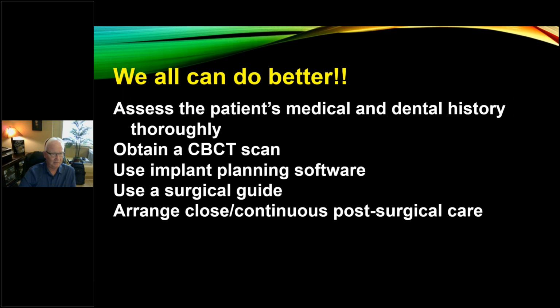Follow up with the hygienist, instruction at the time before you let them go, close monitoring radiographically, post-operatively, maybe at a 3-month, 6-month, annual interval initially, and determine, are they the patient that's only losing that 0.5 millimeter a year of bone, or have they got some other problems going on where they're not in control, or they didn't do their oral hygiene the way they should have, and now they've got more bone loss than you would expect within a short period of time.